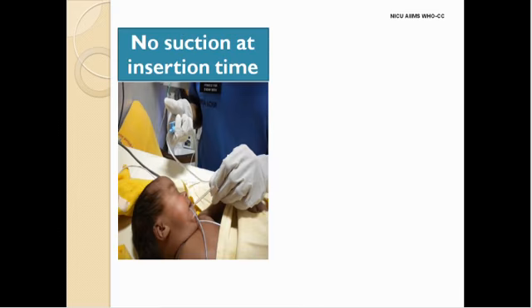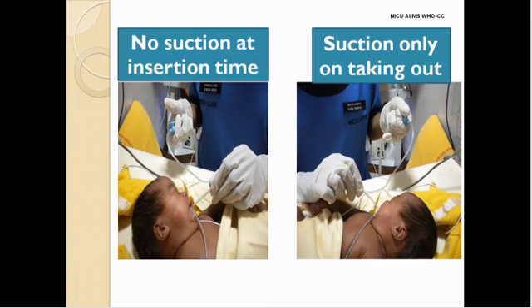The important thing that we should know is that suction pressure is to be applied only when taking out the suction catheter. Never apply suction while you are inserting the catheter, because if a suction is applied during insertion, then it would lead to tissue trauma.